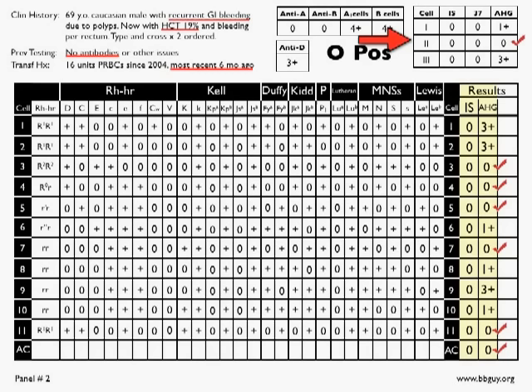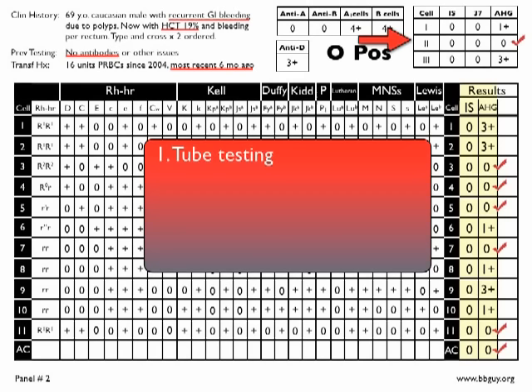Alternatively, you could be seeing a situation where someone's using a different technology for the antibody screen and the antibody panel, which is generally not the greatest idea in the world. Usually when you see just immediate spin and AHG results on a panel, you know it's tube testing because there's immediate spin. It might well be PEG because, as I mentioned before, when you're using PEG for enhancement, you will not have a 37-degree read. Okay, so anyway, what else can we see?